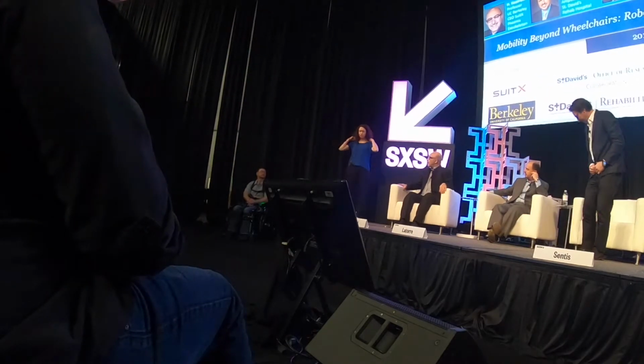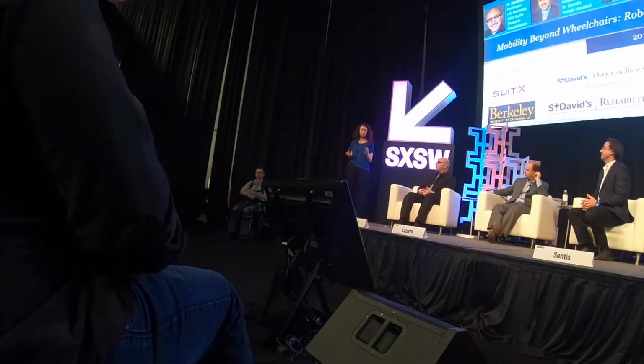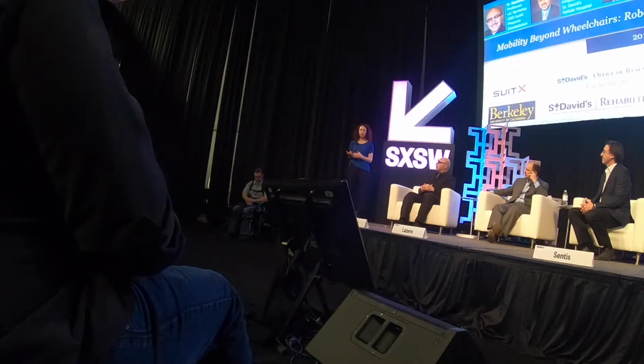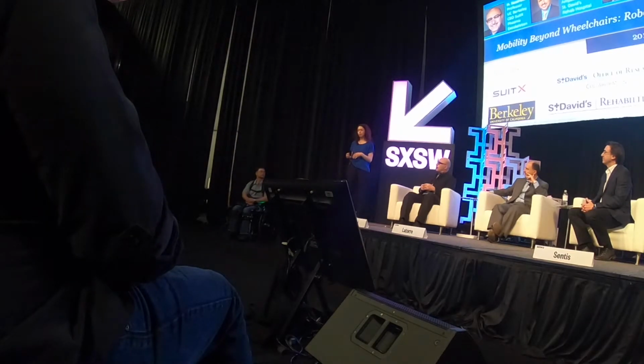Because a spinal cord injury is so unique for every person, you have to be able to gauge how much strength someone has beforehand, and then you guide that person to do as much as they can on their own to train to use the device based on the strength that they have. So for some people, if you have a very high level injury, you don't have any control of your core to hold you up, you don't have control of your legs, and so you are relying solely on the exoskeleton to do the work for you.